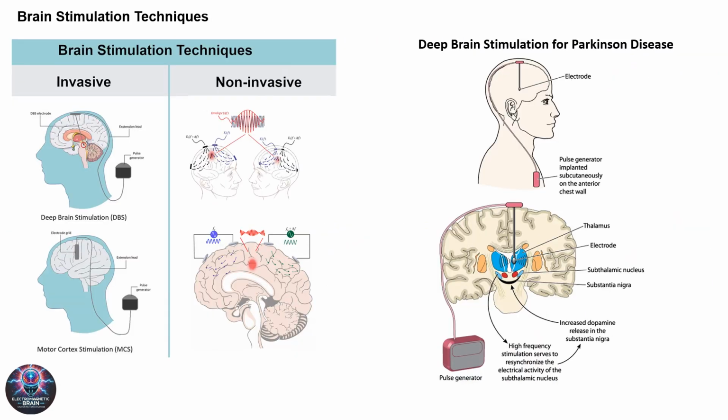The focus of this slide shifts to deep brain stimulation, DBS, a procedure that involves the implantation of electrodes in specific areas of the brain to send electrical impulses that can modulate brain activity. DBS has been used for decades in the treatment of Parkinson's disease and essential tremors, and its applications are expanding to disorders such as obsessive-compulsive disorder, OCD, and depression.